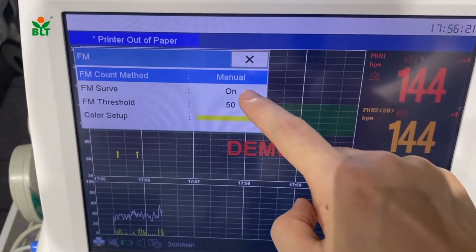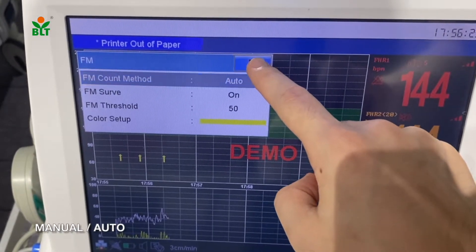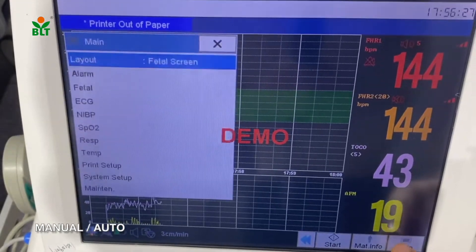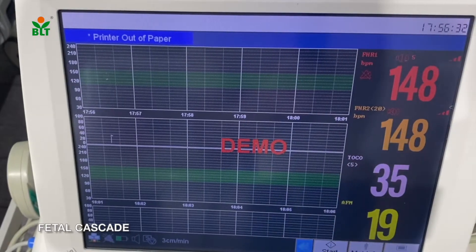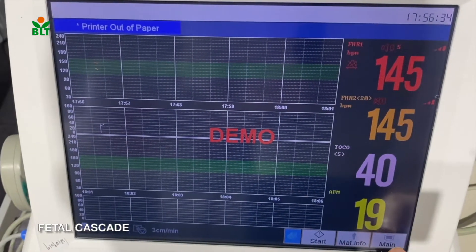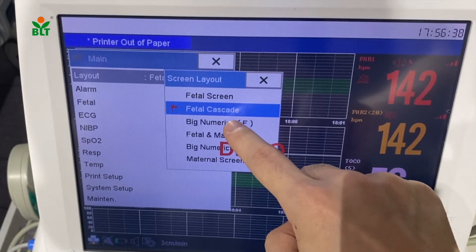For fetal movement, we can choose either manual or auto mode. We can also choose fetal cascade and a big fetal numeric display.